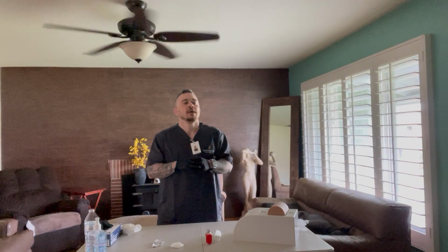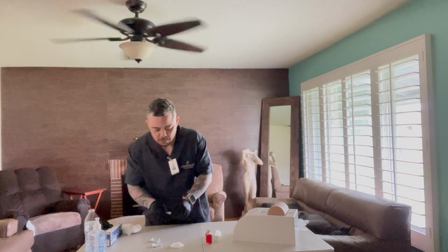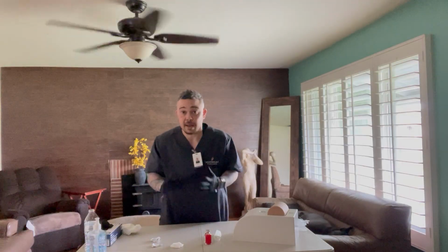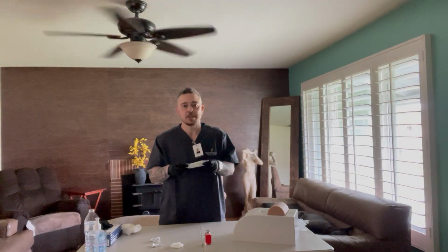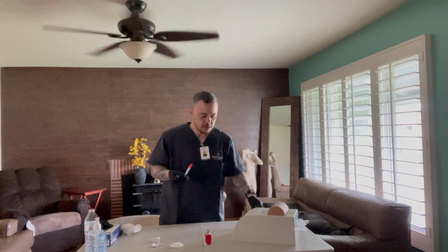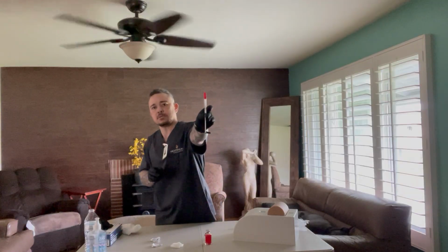Okay, now I'm going to go ahead and draw this up. I'm using alcohol pads, just to let you know that I've already used them because I'm all out. So what I would do is take off the alcohol pad and clean the top of my vial, allow that to dry, and while that's drying, get my 1 milliliter by 25 gauge by 5/8 needle, and while I keep the cap on, pull up air at 1 milliliter of air, as you can see.